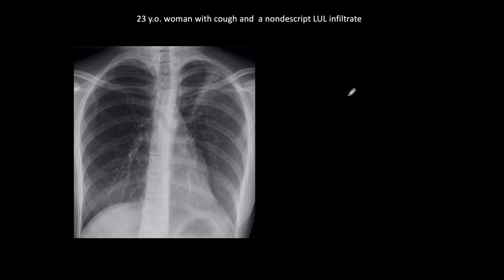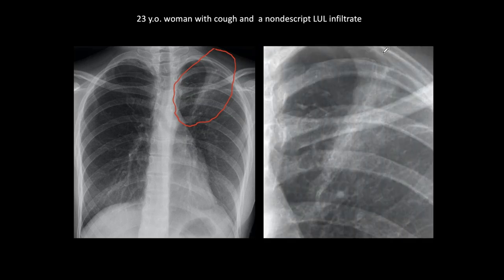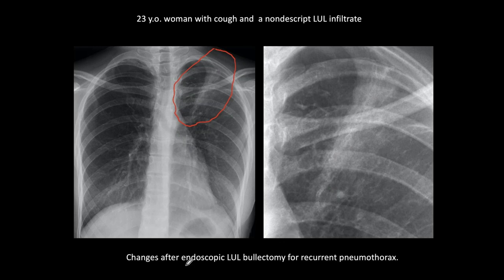Another patient: a 23-year-old woman with cough and a non-discreet left upper lobe infiltrate. There is a triangular infiltrate. Your first impression may be tuberculosis, which always comes to mind with a left upper lobe infiltrate. But in the coned-down view, in the center of the triangular infiltrate there is a longitudinal ring chain of a surgical staple. So we know this patient has been operated on, and these are changes after an endoscopic left upper lobe bullectomy for recurrent pneumothorax. We can identify that as a non-significant finding secondary to surgery, and skip any further examination.